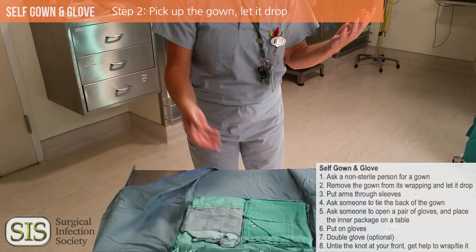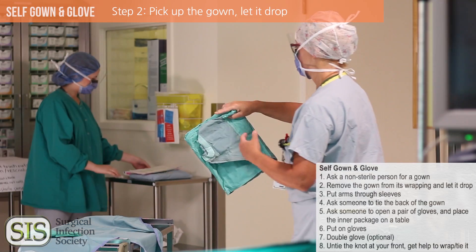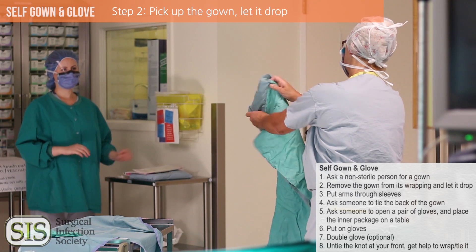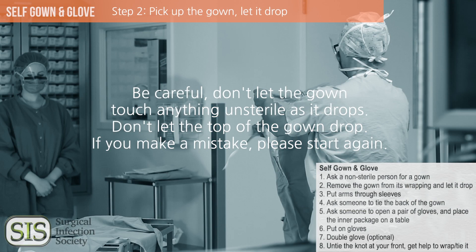Pick up the whole folded gown, raise it above the table, move back from the table, hold it by the neckline and let the bottom drop. If you touch the outside of the gown, if something unsterile touches the outside, or if the top of the gown drops, start all over again with a new gown.